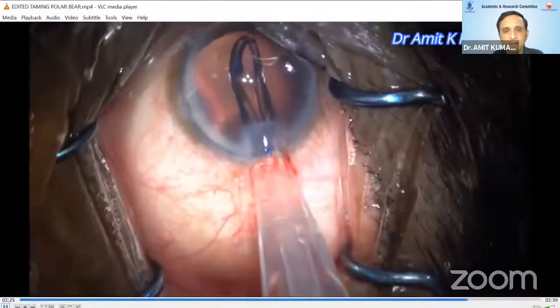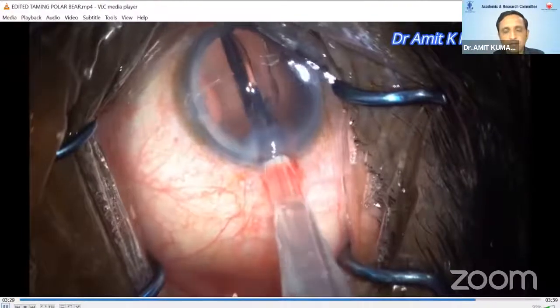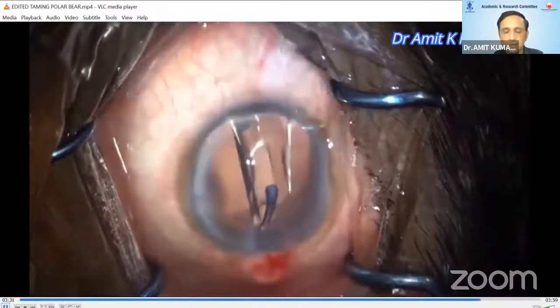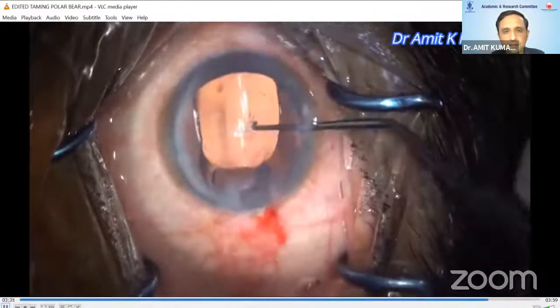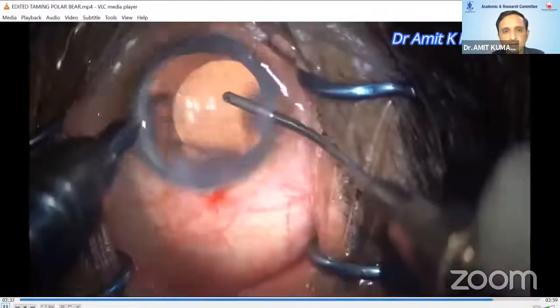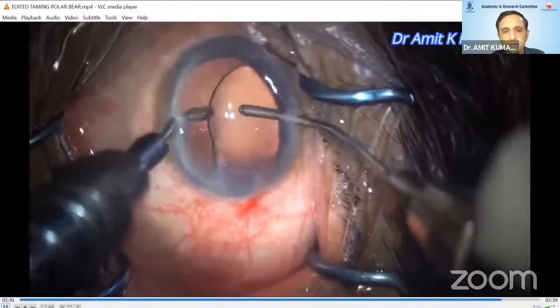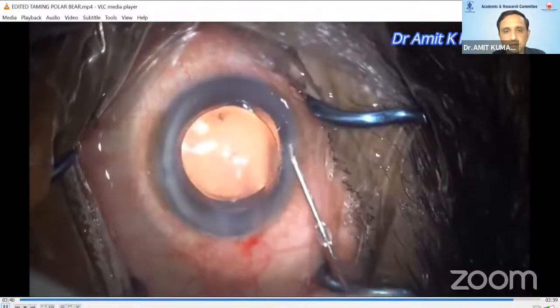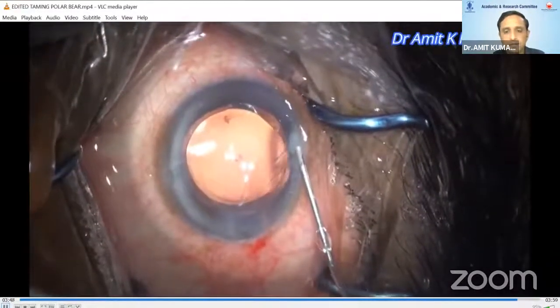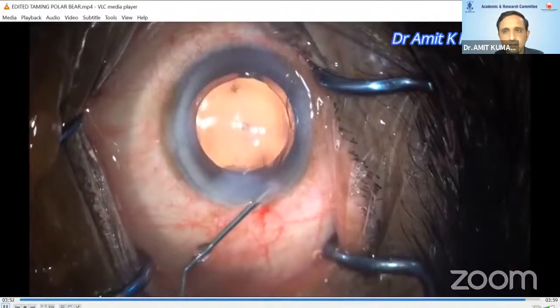In the last step, you can remove the central plaque very easily in a flower petal direction — first loosening all the cortex from the periphery. Always keep in mind to do the viscofluid exchange before removing the irrigation cannula; always fill the chamber with visco to avoid unnecessary shallowing. To conclude: at least 5.5 millimeter oval-shaped rexis, no fluid wave crossing the center, very low parameter central trenching in both directions, separation of all quadrants from periphery but keep attached centrally, viscofluid exchange, and bimanual IA in a flower petal fashion.